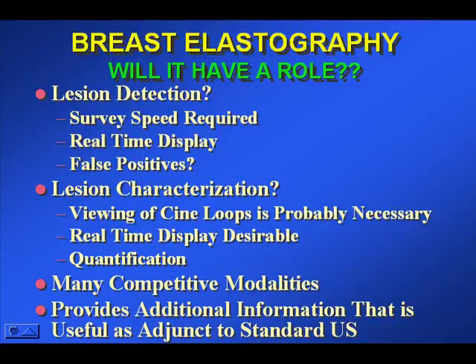The things that are required for characterization, I think you need to use video cine loops to look at the entire elastogram rather than a few static images, and real-time display is definitely desirable. Quantification may be helpful in the future to further increase specificity.